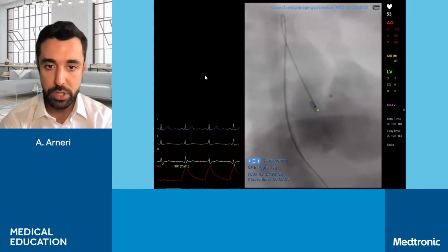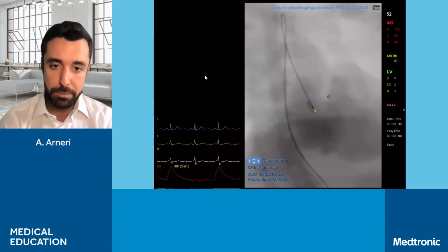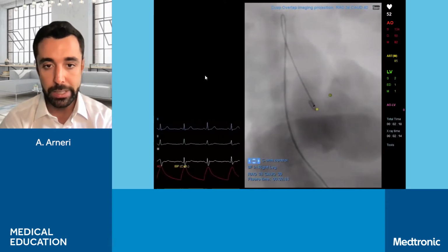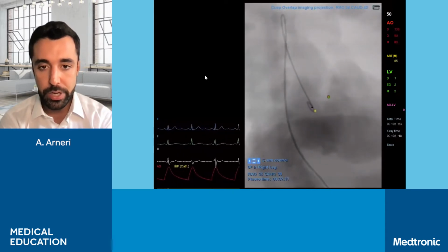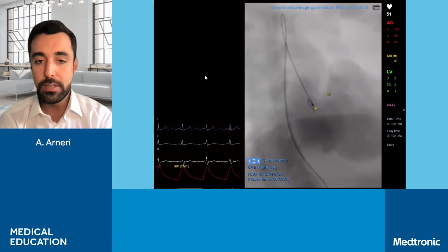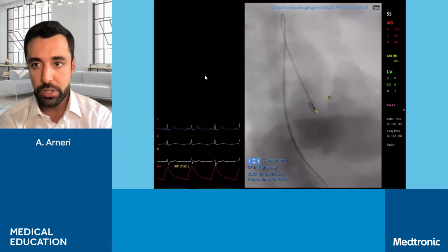Maybe we can do a contrast injection here. Okay, so we see that the pigtail is already pushed onto the nadir of the non-coronary cusp, and the other 2 are correctly overlapped. The other projection, on the contrary, is the one in which we have the 3 cusps aligned and at the same distance one to the other. That's called 3-cusp view. So we can go in that projection.